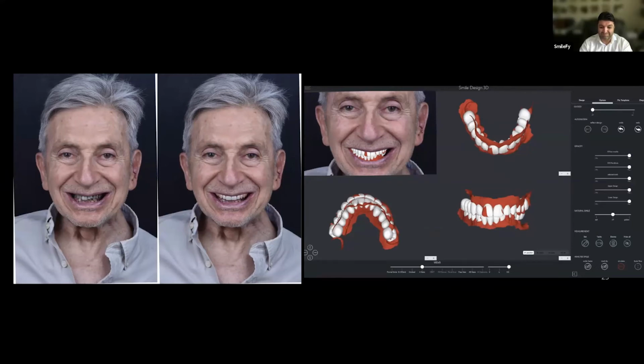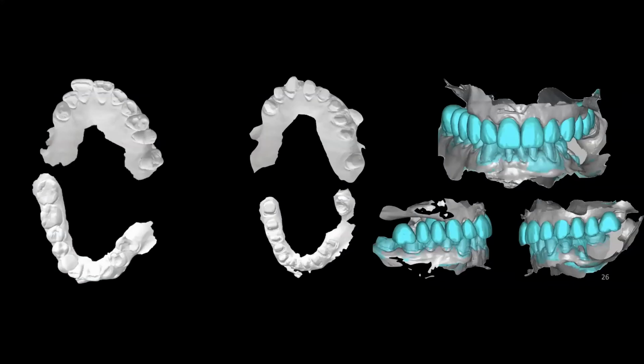Because with Valentin, in a few seconds, they tell you his needs. The first step of the workflow is the intraoral scan.